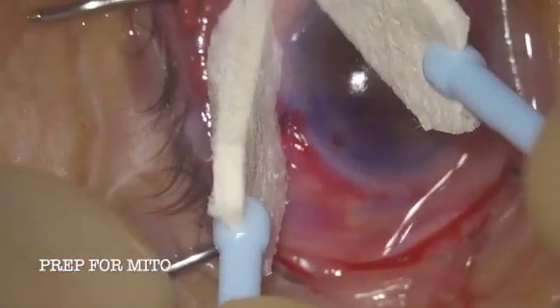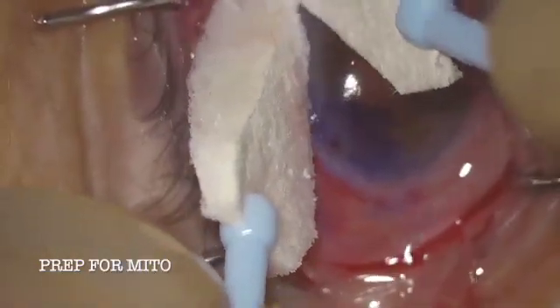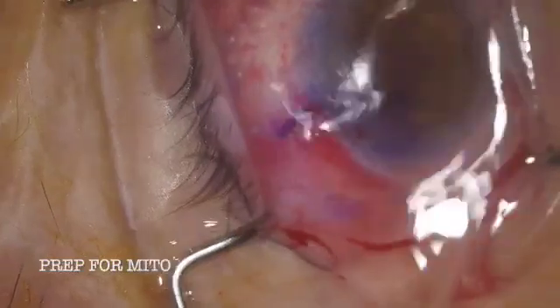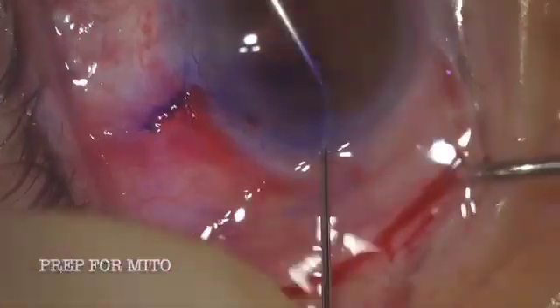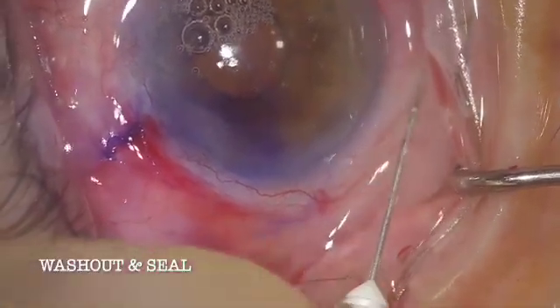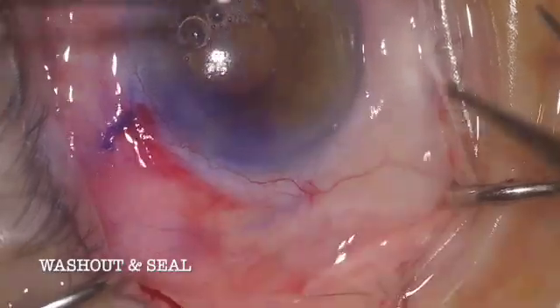With the sutures placed and the system closed, we can get ready for mitomycin, which we've just injected. I'm pushing the mito away from the limbus, sparing those limbal stem cells from mitomycin exposure and pushing it posteriorly where we want aqueous drainage into the bleb for long-term maintenance. At this point we have the Xen placed where we want it, a nice bleb forming with mitomycin applied. Now we just need to wash out the anterior chamber of viscoelastic, seal the incisions, check final placement one more time, and make sure everything looks good.